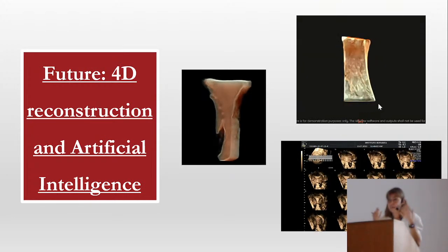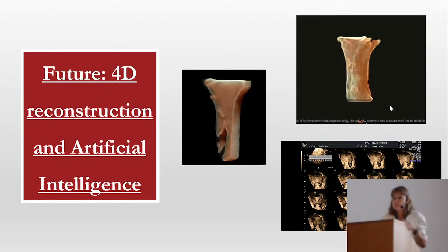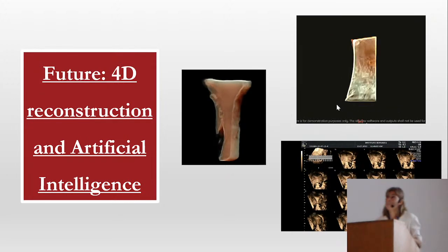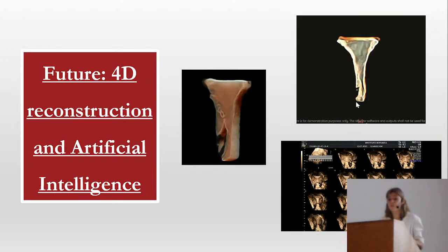In my mind, I want to be able to see the whole uterus movement, and I want a machine that is able to let me know what movements they have, like in a heart. It's already made. This technology is already made. It's nothing that we cannot do.